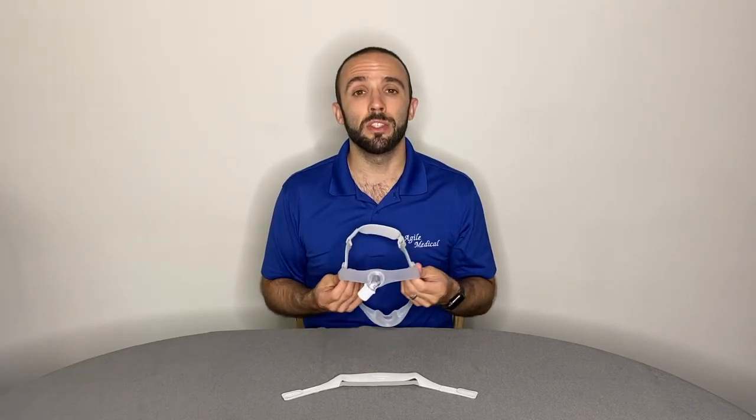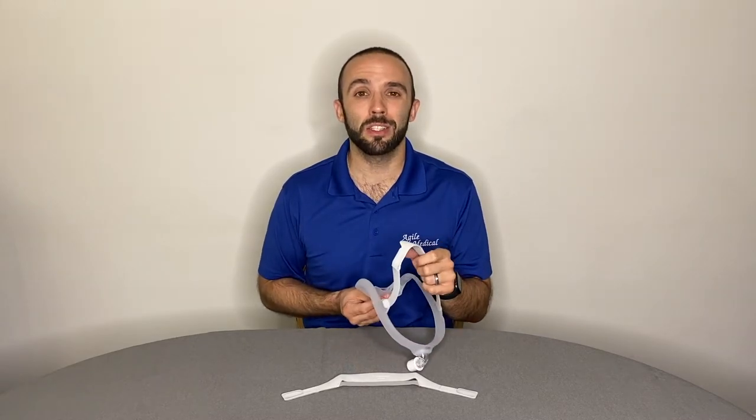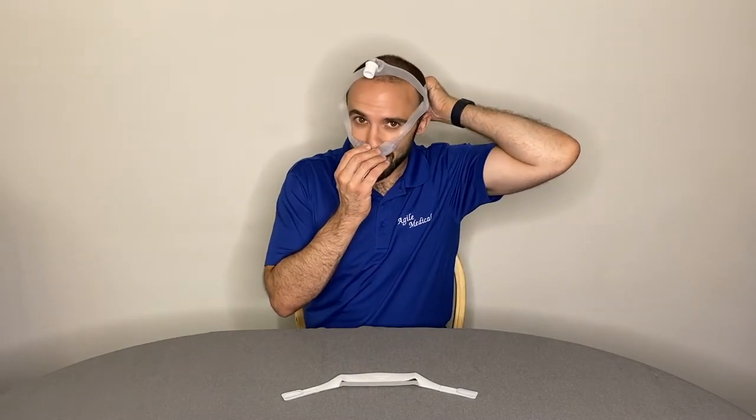Each stability arm is notated with an R and an L for right and left. Again, when it comes time to put your CPAP mask on, hold the nasal cushion in place and slide the mask frame over your head. Use the velcro tabs to adjust accordingly and once more, avoid overtightening.